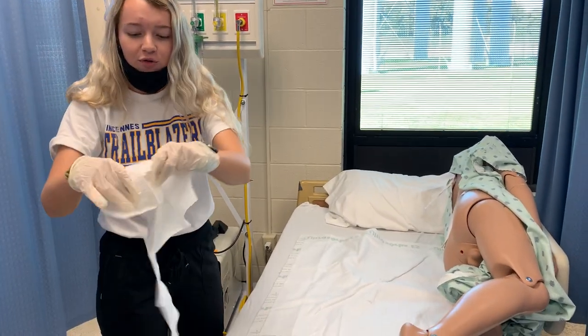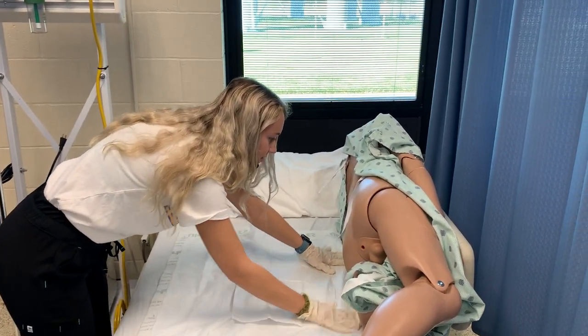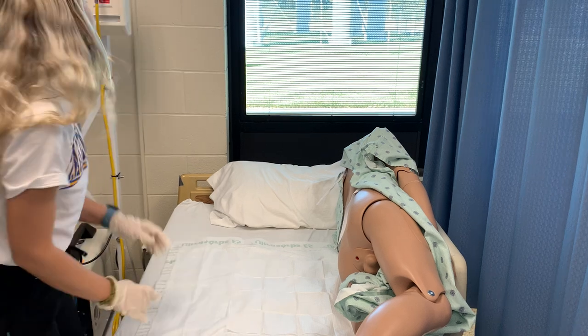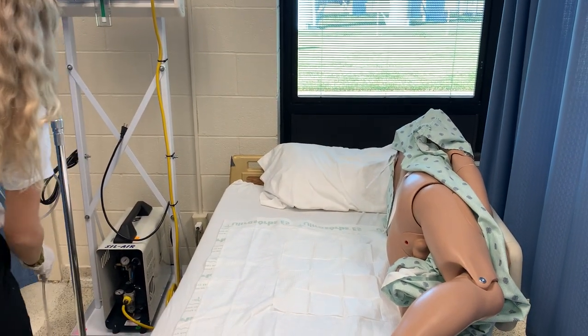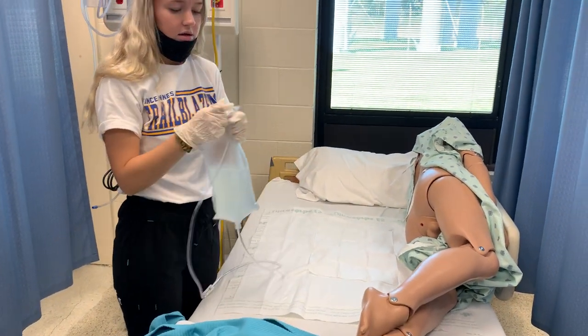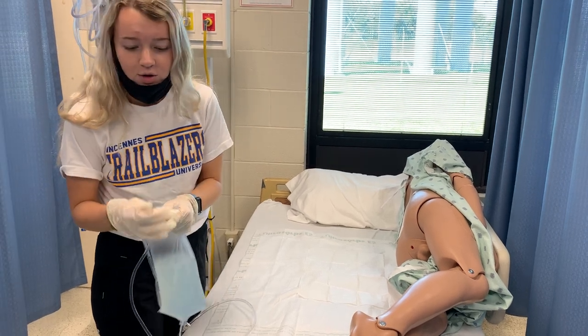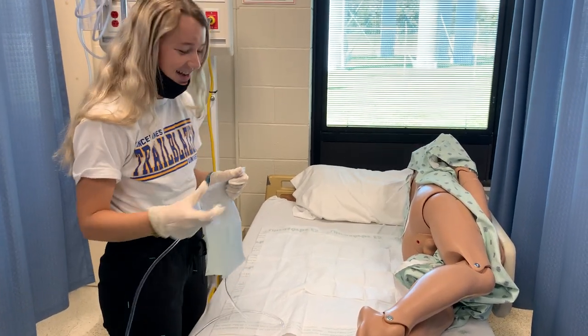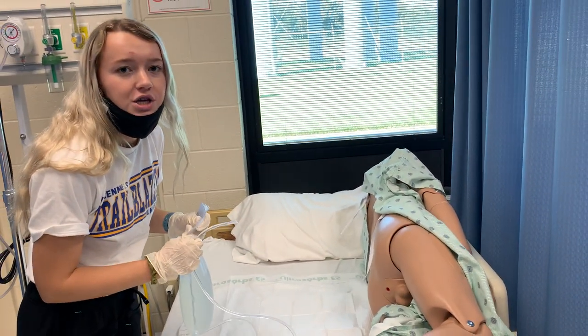Put our waterproof pad underneath. I'm going to lower my side rail. I'm going to put on my procedure gloves. I'm going to position the patient on their left side. Take the end off of the tube, and then we're going to lube it up. Put some extra lube on the end of it.